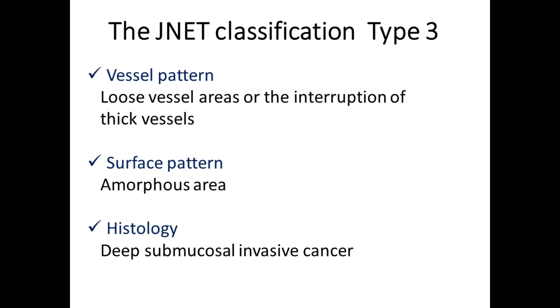J-Net Type 3 lesions show loose vessel areas and the interruption of thick vessels as a result of the destruction of vessel structures by cancer. Similarly, the surface pattern also becomes amorphous due to the invasion of cancer. J-Net Type 3 refers to deep submucosal invasive cancer.